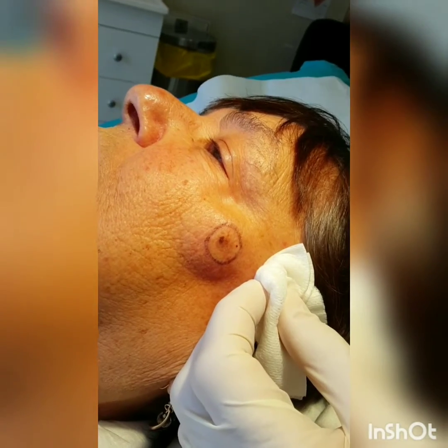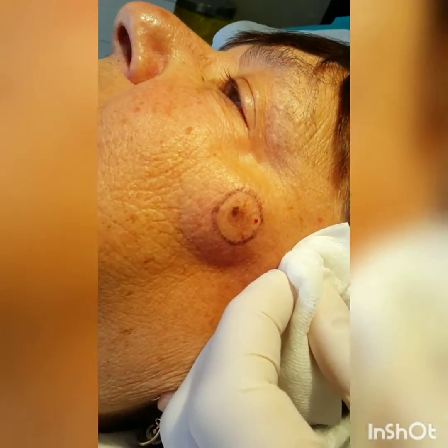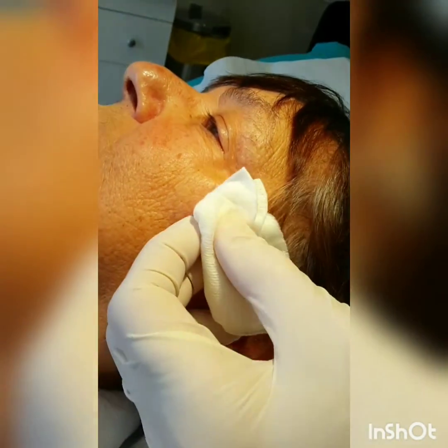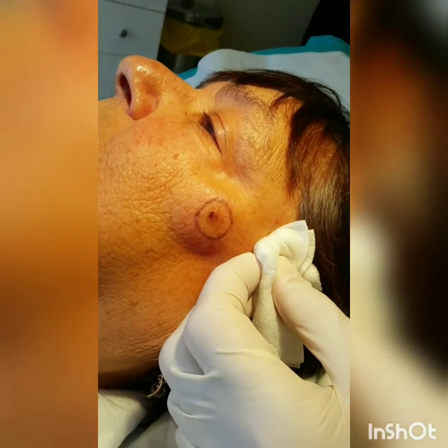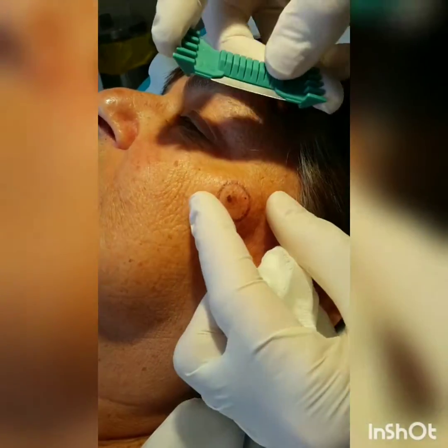The best biopsy technique for a lesion that is suspicious for melanoma is excision with 2mm margins. However, in this case our suspicion of it being melanoma is low, and so we've opted for a shave biopsy.